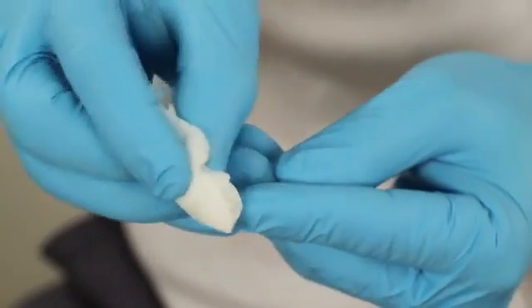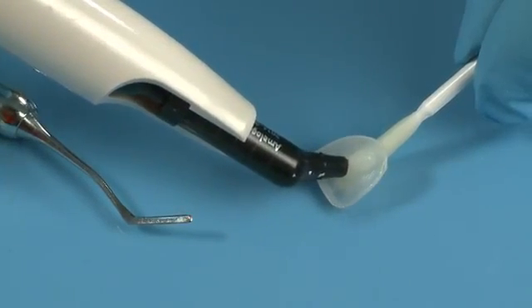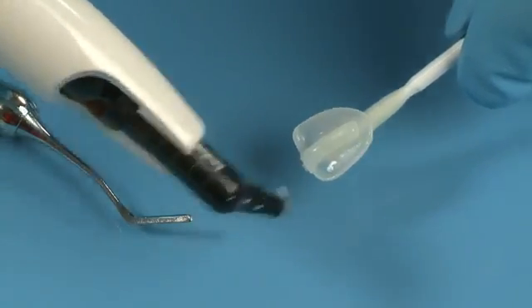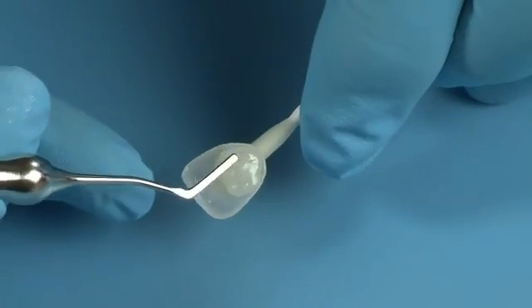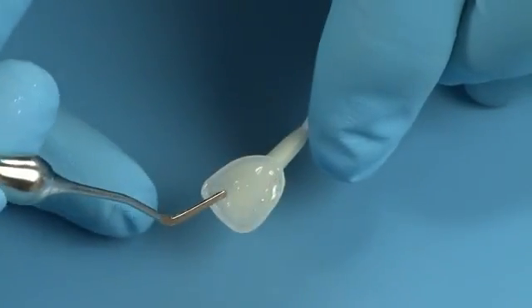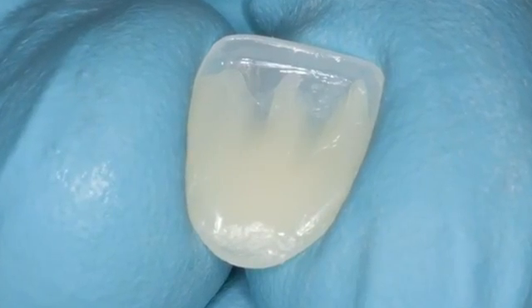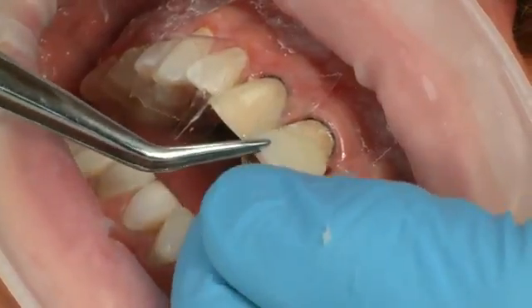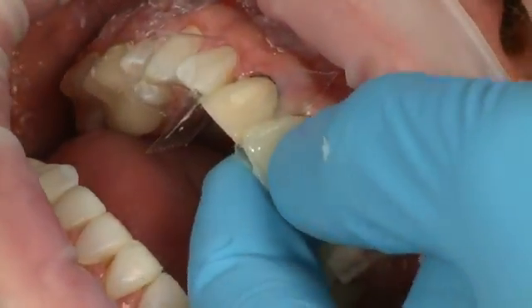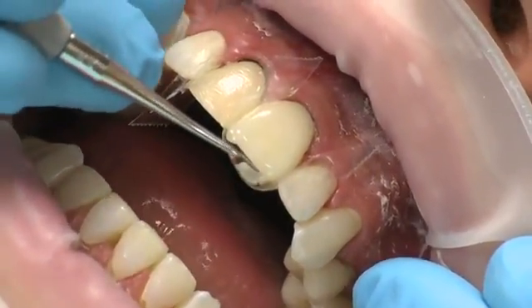Prepare to work with Amelogen Plus by cleaning your fingers with isopropyl alcohol wipes. Express approximately one centimeter of the predetermined shade of Amelogen Plus into the inner surface of the composite veneer. Using a composite instrument, adapt the composite to fill all areas of the Edelweiss composite veneer. The clinician may want to characterize the composite as desired inside the veneer to better match adjacent dentition. Place and press the Edelweiss composite veneer into position, allowing the excess composite to be expressed from the edges of the veneer. With an instrument, remove the excess composite from the incisal edge.